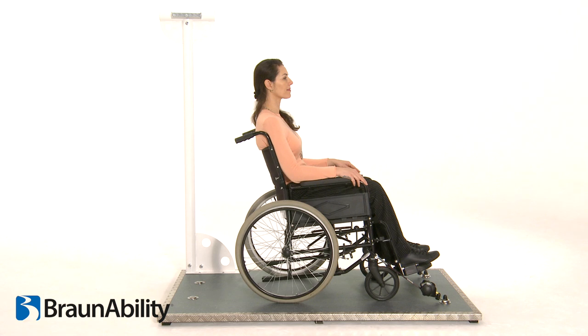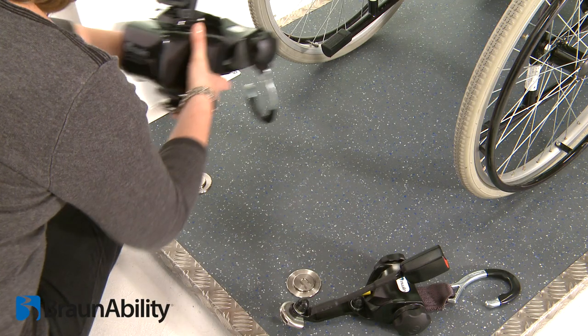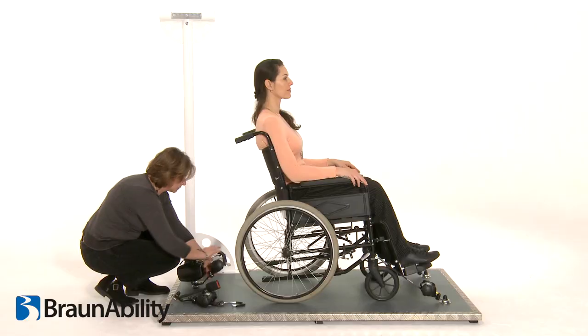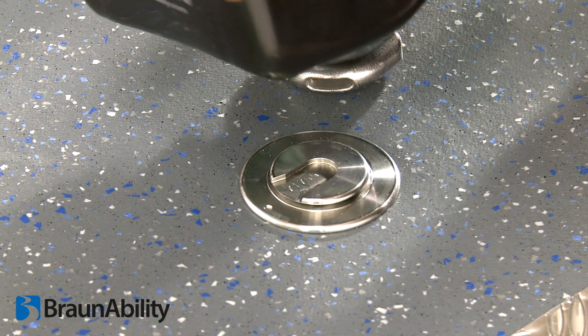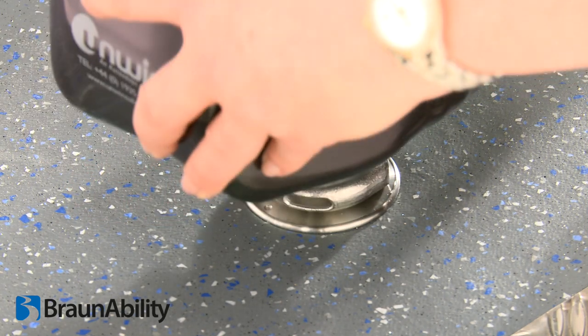When fitting the rear tie-down, ensure that the inertia reel unit is placed on the wall side of the vehicle, nearest to the third fixing point, and the stalk to the aisle side for a quick release in the event of an emergency. Attach the rear combined unit onto the rear anchor points by aligning the button within the cleat to slot on the floor anchors.